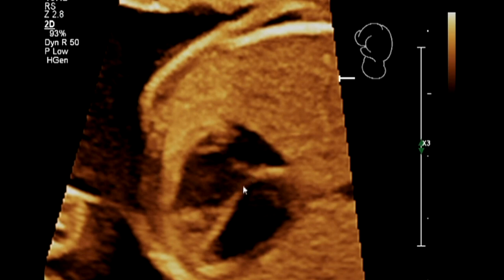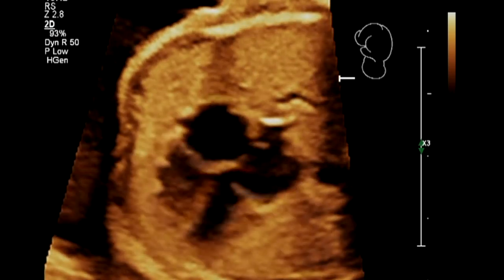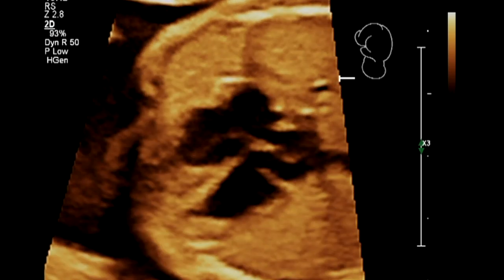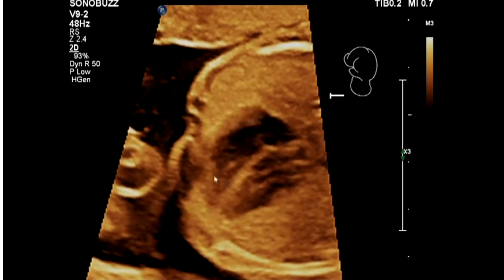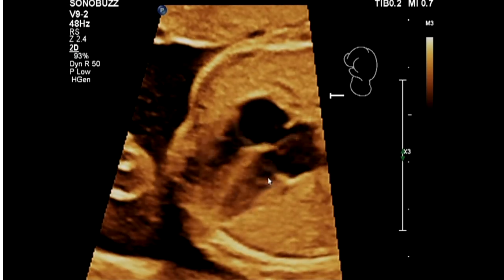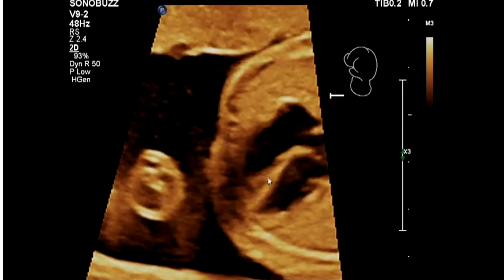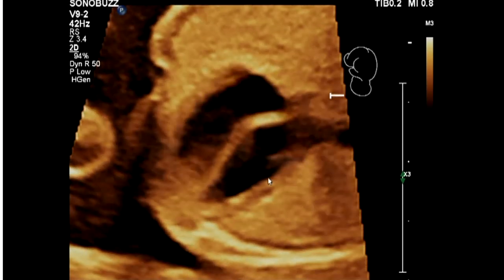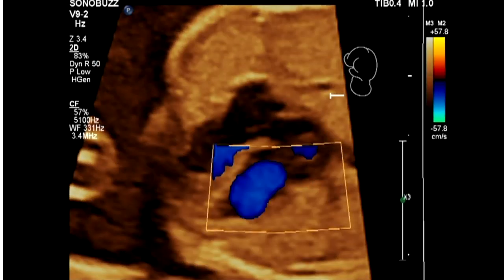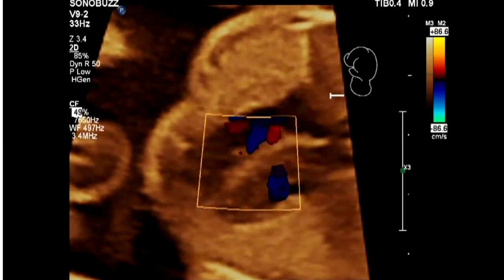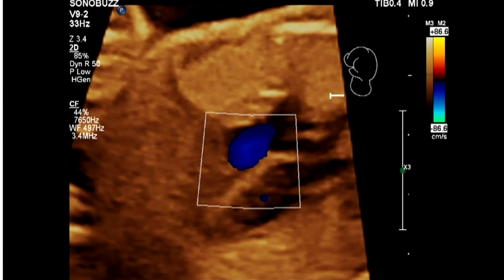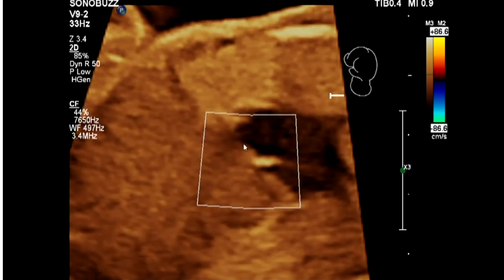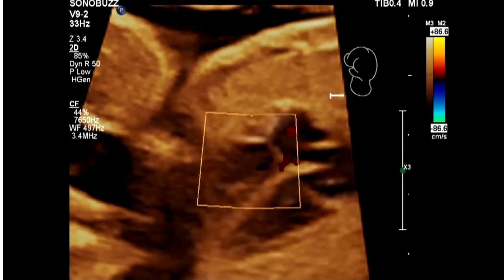If you look carefully you'll see it looks like a dropout here because this is not a good angle to look at the inlet septum — it looks like a big VSD but that's artifactual. In this position we might as well look at the mitral valve; it looks like it's opening up well. Then I'll look at the tricuspid valve up here, and of course you should put color on because it's a good angle. I'm optimizing the color, and you can see there's no tricuspid regurgitation.